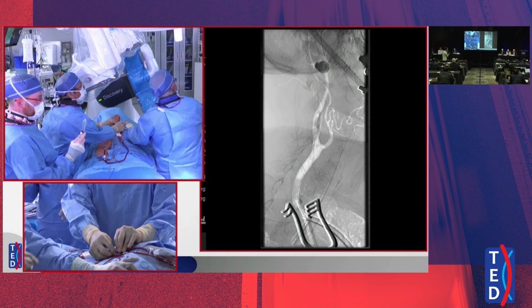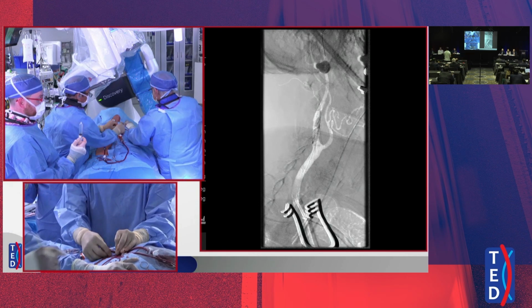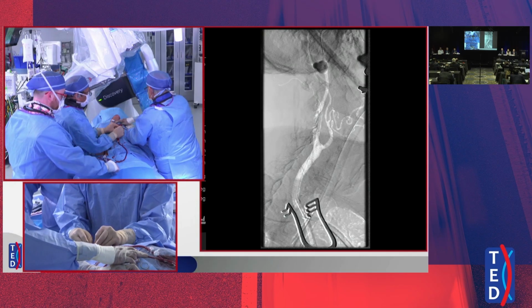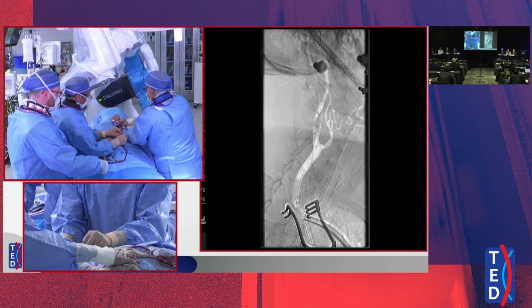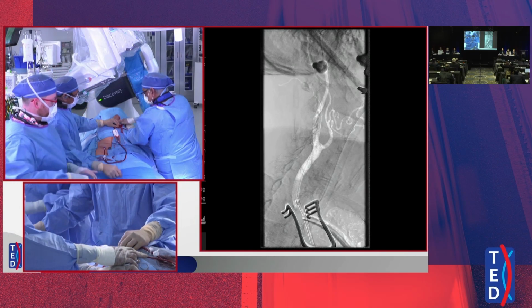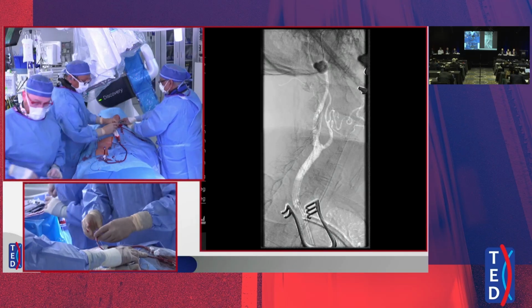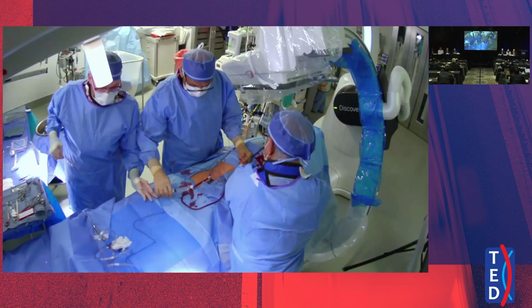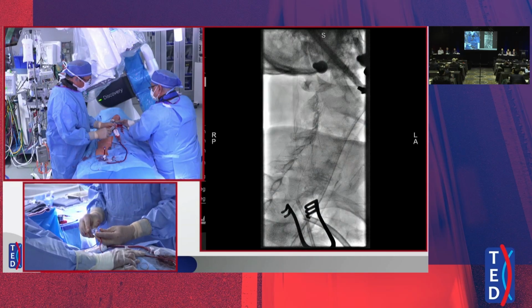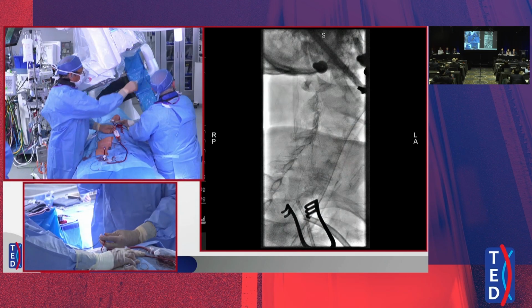Blood pressure is all good. Everything looks good. Let's take this wire out. I'm not a big fan of post-stent balloon angioplasty, and that is where I think the new NeuroGuard and the Contigo systems are most focused on this post-dilatation expansion. Can you wipe the markers off, please?